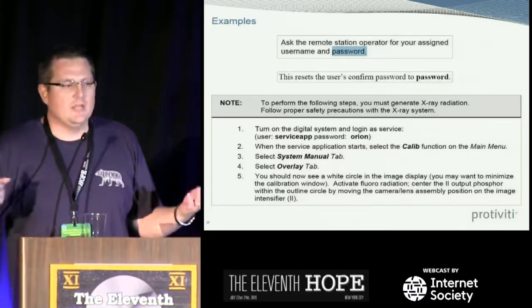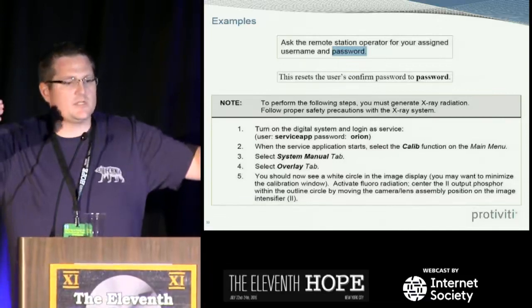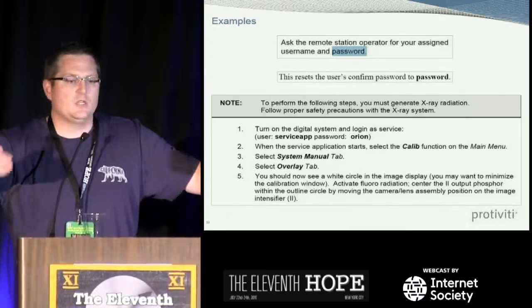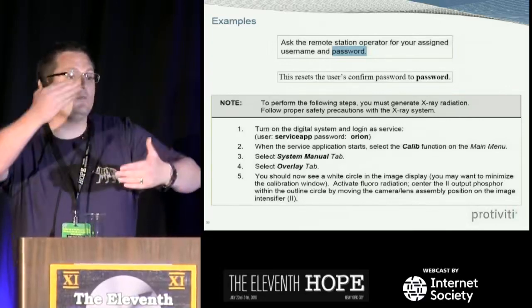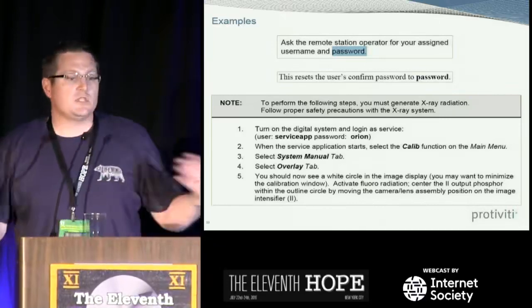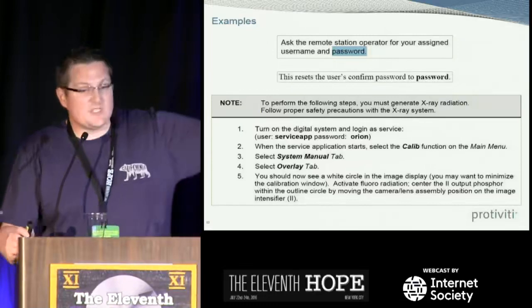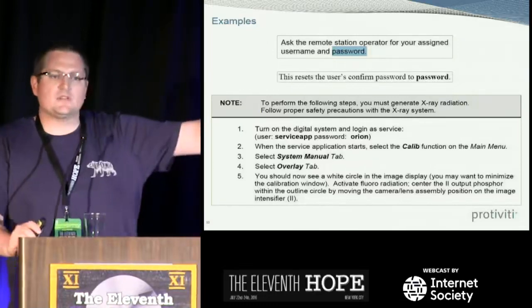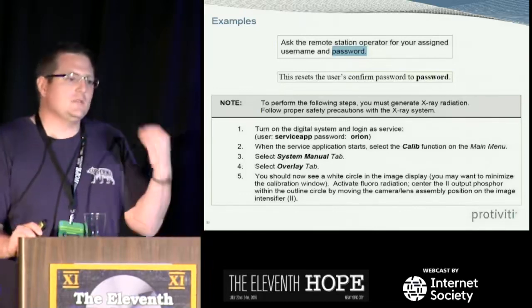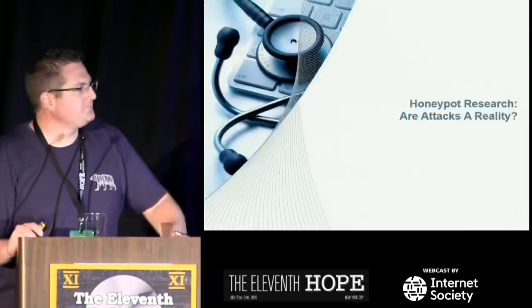Well, if you capture that traffic between the application that actually posts to a web server on the actual X-ray system, it's not encrypted. It's an XML file that gets passed in many cases. You can modify those parameters. What happens if you modify those parameters to be higher or the exposure length to be different and then post it? Does it accept it? So that's the type of thing that we look at. This specific system, I haven't tested. I have done stuff exactly similar to this on other manufacturer systems, but that gives you an idea of how we try to find intentional use and then make it do something else.